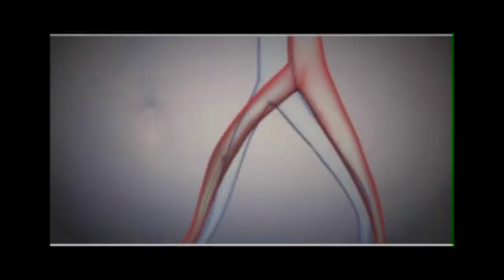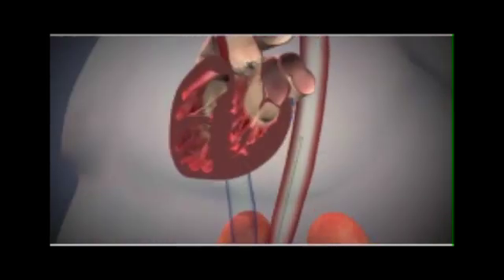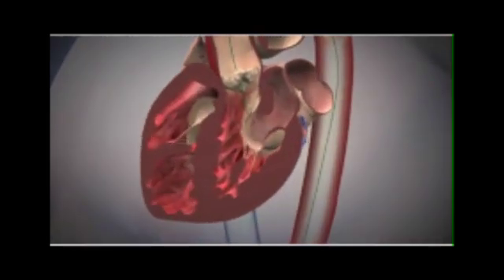The TAVR procedure is done in the heart catheterization lab. We enter through the groin with a very small incision, introduce a small tube through which a wire is tracked back to the aorta and we cross the aortic valve with that wire.